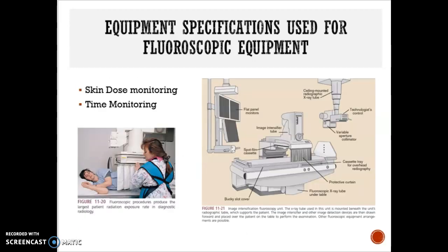When it comes to fluoroscopy, we have to monitor the skin dose. If the skin dose received is in the range of 1 to 2 gray, regulations or the U.S. Food and Drug Administration requires that a note be placed in the patient's record or on the patient's chart. As a radiographer or technologist, it is generally your responsibility to monitor and document the fluoroscopy time.